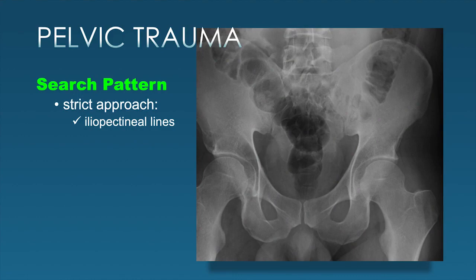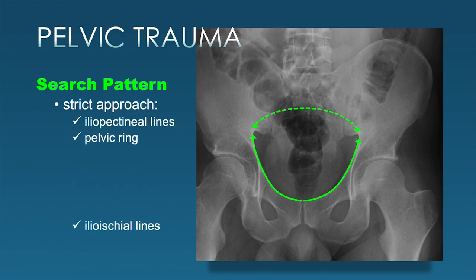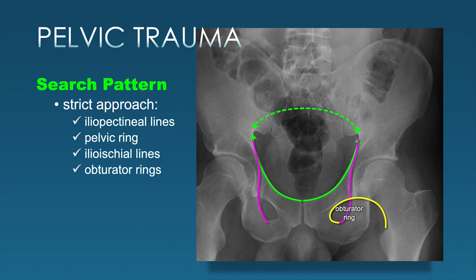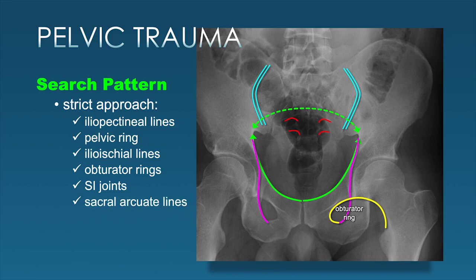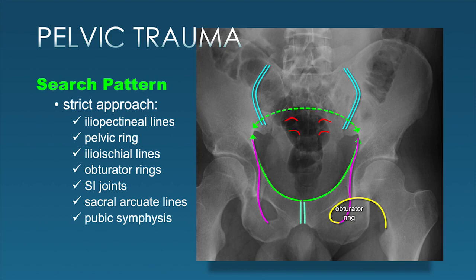The search pattern on the AP view should have a strict approach. We look at the iliopectineal lines bilaterally, follow them posteriorly to see if we have an intact ring for the bony pelvis. Follow the ilioischial lines into the obturator foramen and loop around the obturator ring completely into Shenton's line—we want to see nice smooth curves all the way through without disruption. We can see the anterior SI joints more prominently than the posterior SI joints on the AP view. Try to look through the bowel gas to assess the sacral arcuate lines and look at the pubic symphysis as well.